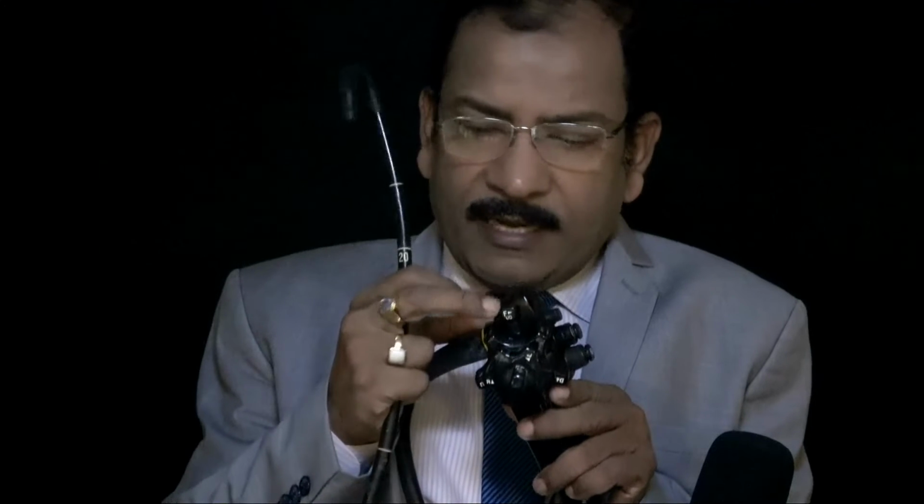Now when you move it up, and if you want to lock it, there is a button here and it is locked. Now see, I am not holding it, but still it is locked. This is the button here, this is a lock button, and this is unlocked, and this is locked, this is unlocked. So this is for locking and unlocking the outer angulation wheel. This is outer angulation.